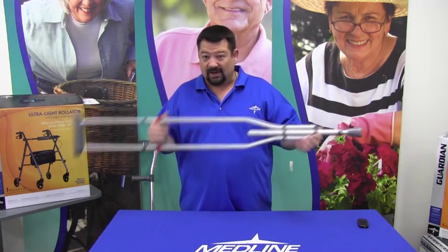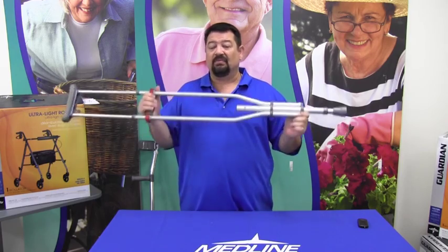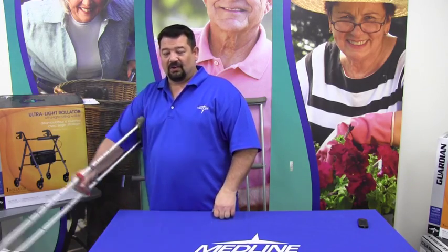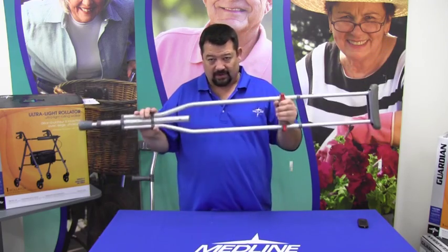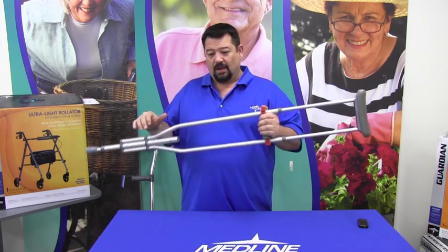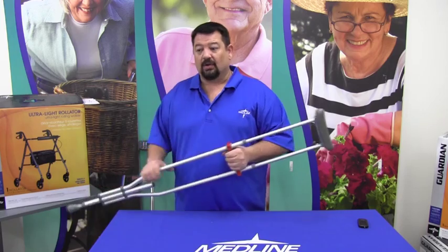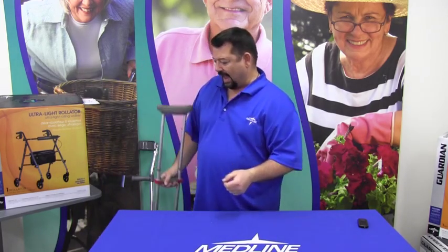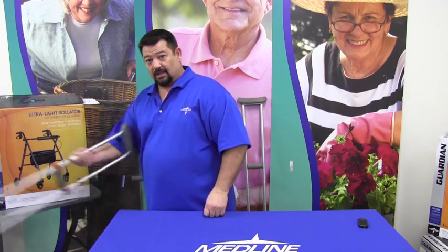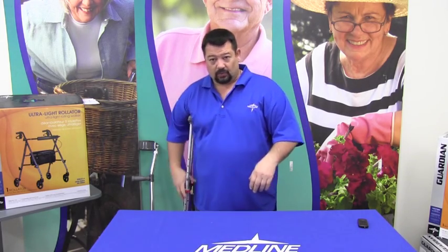A lot of people get carried away with this. They think that they're very easy to use, which they are once they understand. But someone who gets a pair of crutches for the very first time, the first thing they're going to do is pay attention, walk about a dozen steps or so, and then they're going to drag that tip and stumble. So what we need to do is reinforce in their minds how to properly walk with these, and make sure that they understand that proper walking will stop that. Don't drag the tips on the ground. Don't take too big a step. Make sure that the angle they're using is a standard step. If you go a little too much, and if there's a slick spot, then the crutch goes away and you're in bigger trouble.